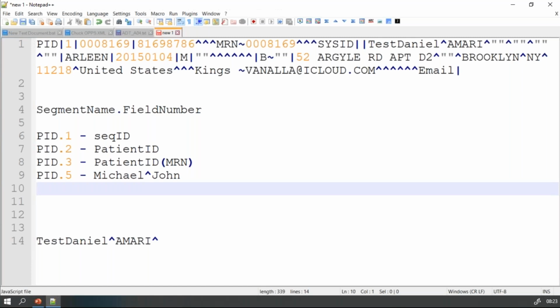In XML, you define a certain XSD and say this is the schema we are going to use for a certain integration. In the same way, when we are integrating between one hospital and one lab, the schema definition between them could be different from some other lab they are implementing an interface with. All of these definitions and validations with respect to that schema will be done in Mirth Connect transformations.